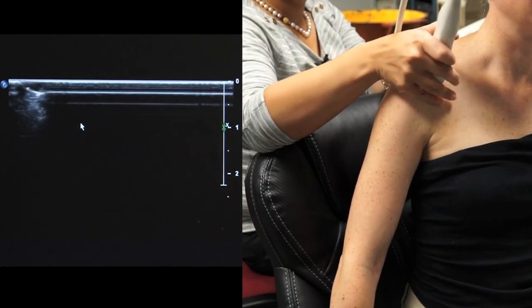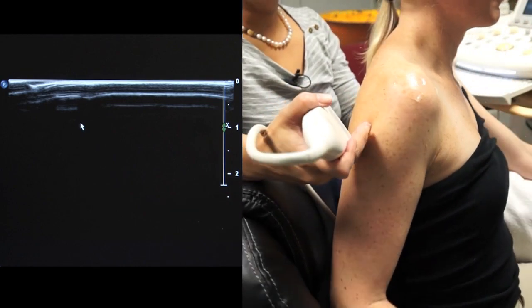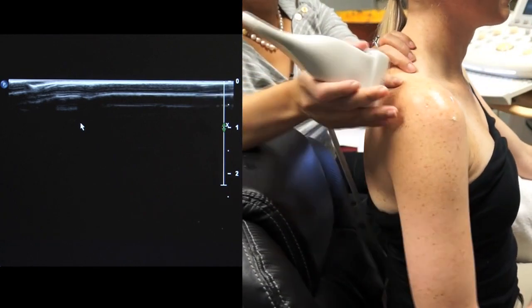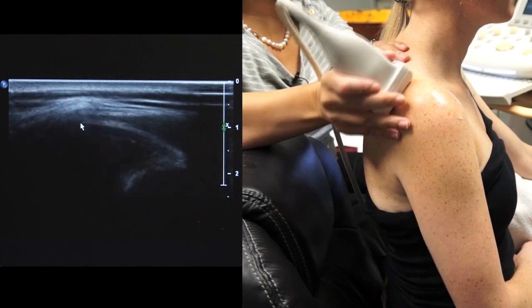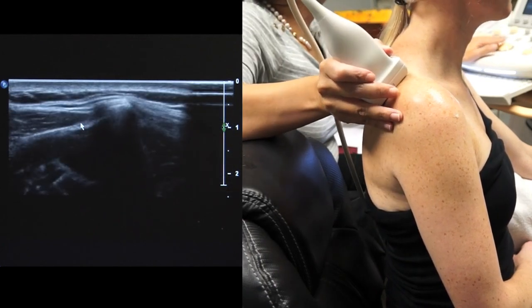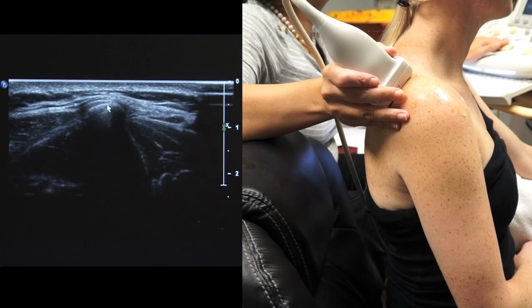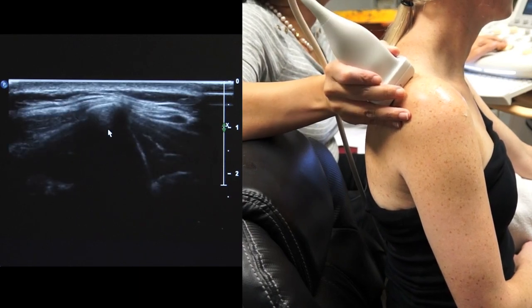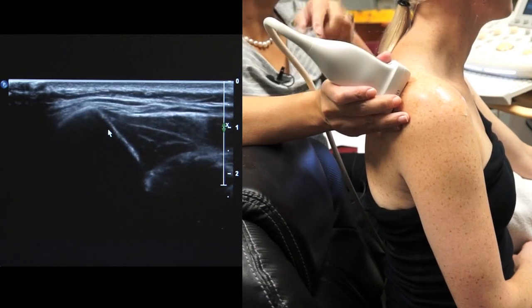All right, moving along to the infraspinatus. Just want to again point out the bony landmarks. Now the infraspinatus is infra to the scapular spine. So here on the screen we see this is the scapular spine. Remember now the orientation with your marker facing at 12 o'clock.